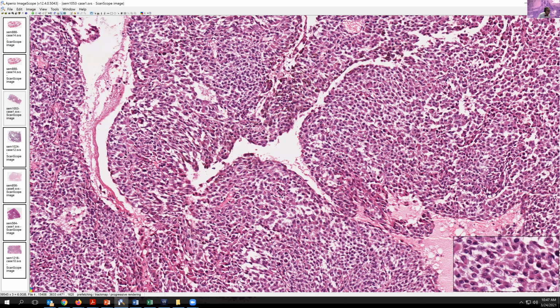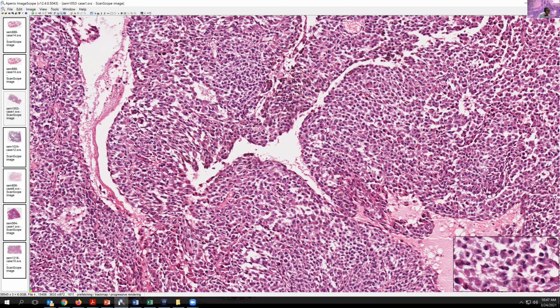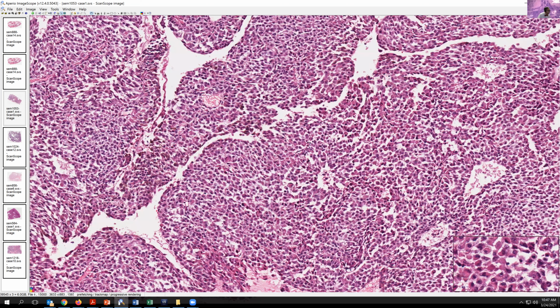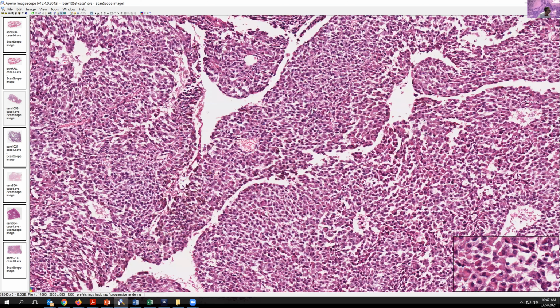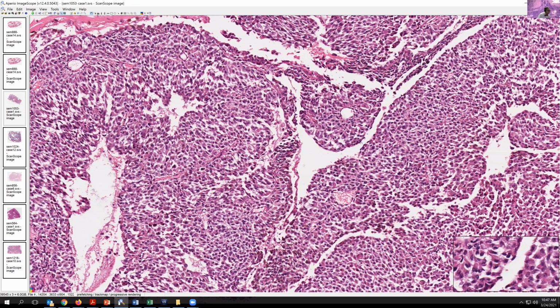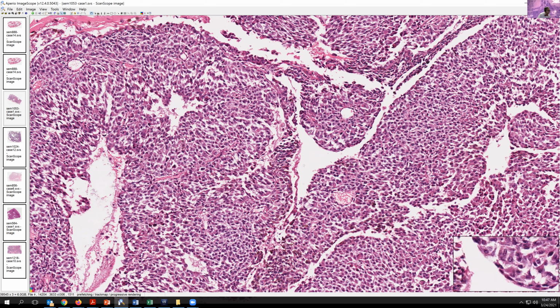If we had maybe a little higher magnification scan, we might see even a few grooves or something of this sort. But these very eosinophilic cells, and we notice here that many of these cell groups are invested by almost an endothelial type lining.